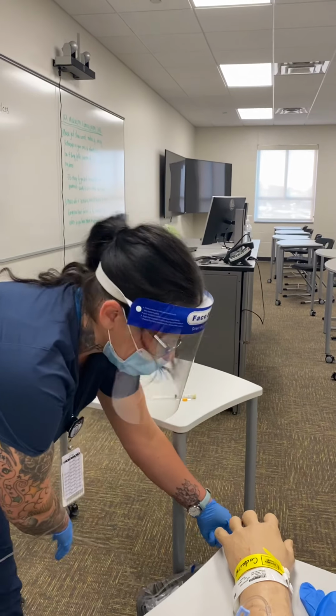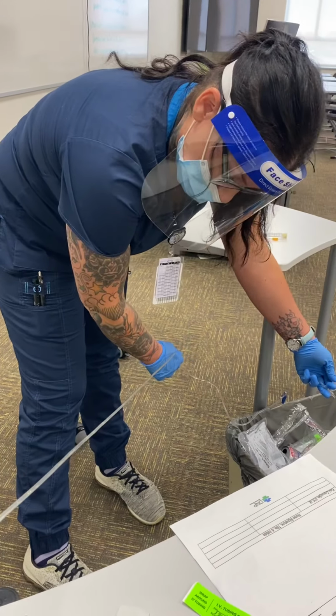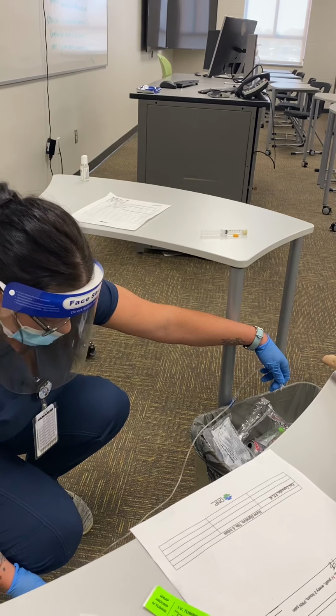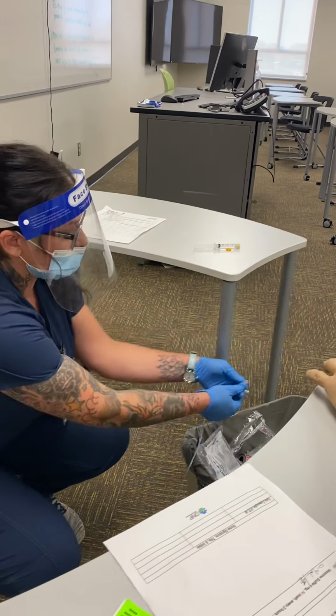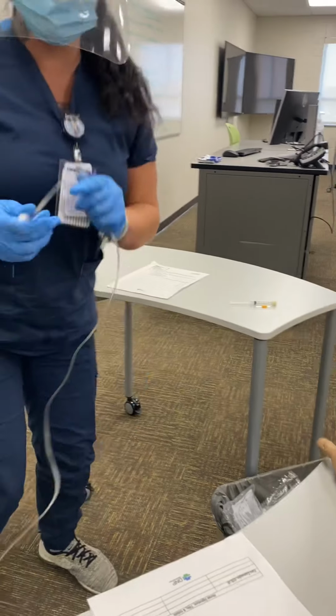And watch the line. Looking for bubbles. There's a few in there, so I'm getting them out. Kind of checking the whole length of the line, and I think it's good. So I would put this back on, making sure it stays sterile.